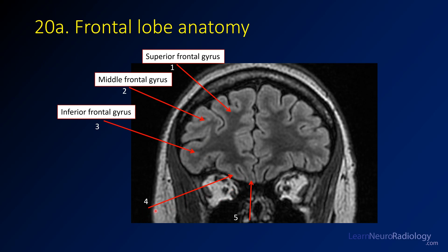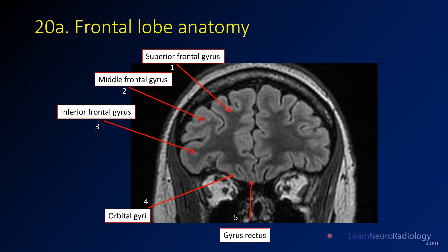Two labeled structures here. This one I've labeled a bit generically — this is the orbital gyri; in this case, this is the medial orbital gyri, but we'll talk about that a little bit more in just a second. And this final one is the gyrus rectus.